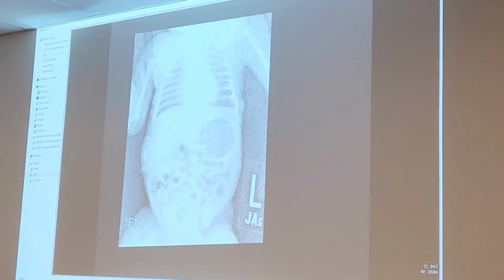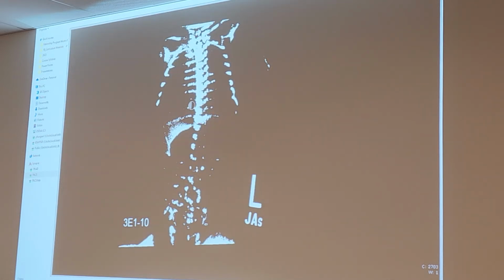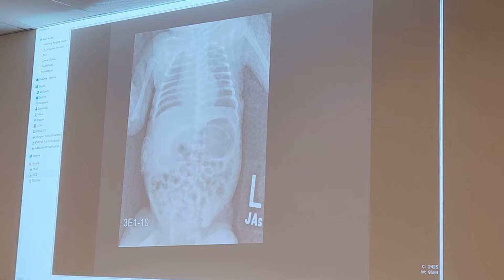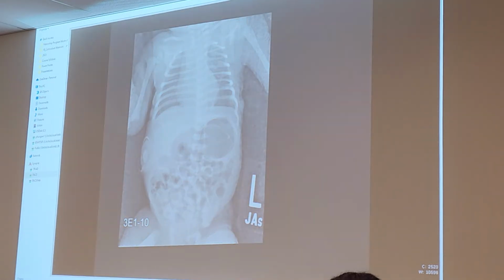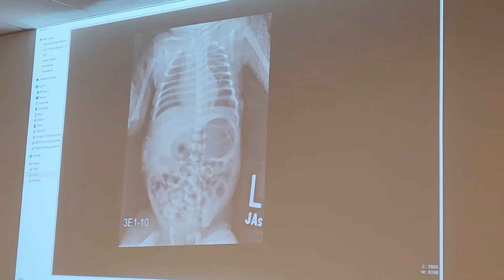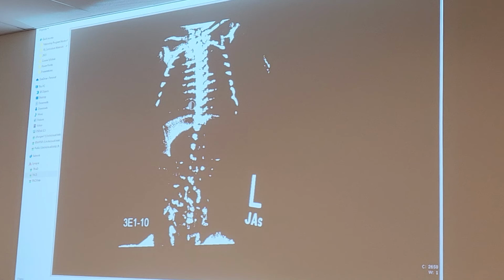I'm moving up and down here. I can also adjust my windowing. So I can do this, going side to side. So right now I'm moving my mouse side to side because this is width, window width. So over here, that's the contrast here.